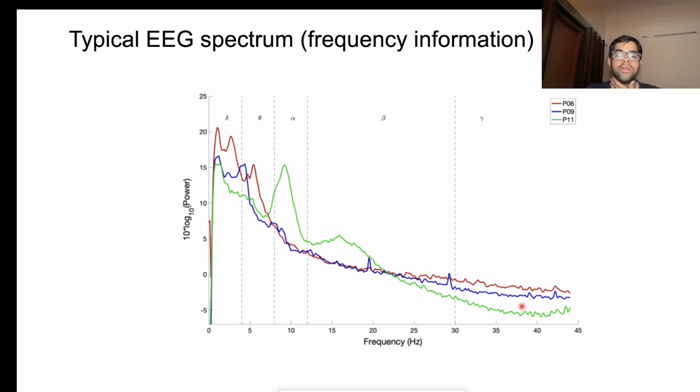This type of noise is present in all biological signals. We will also discuss why it is present if we have some time, but I don't think we have much time. If you give me 5 minutes I can explain. Any doubts about the typical EEG spectrum, or why the characteristics look like this?